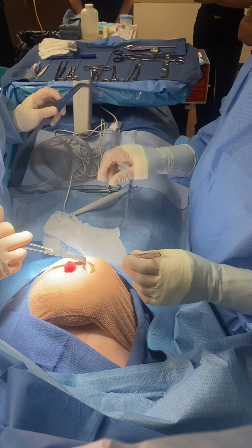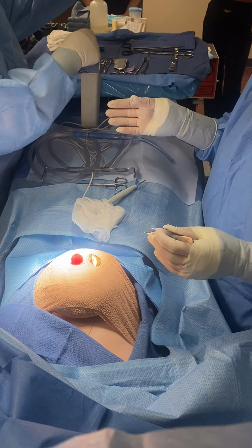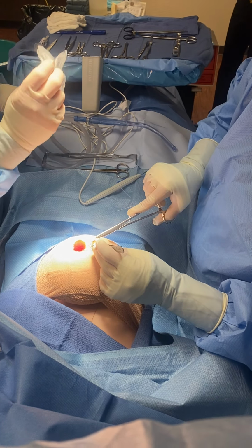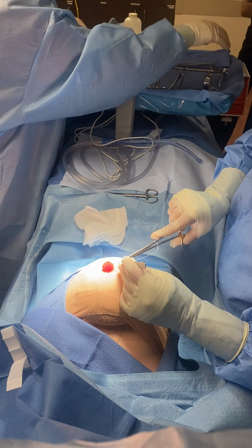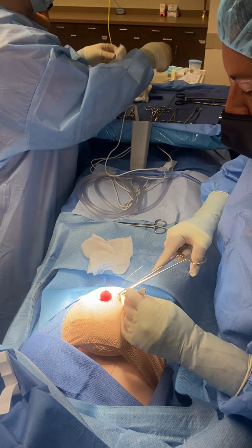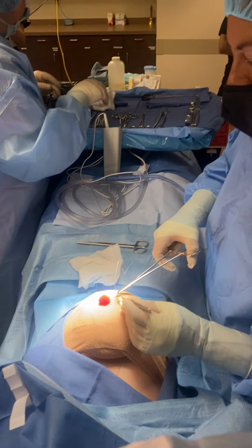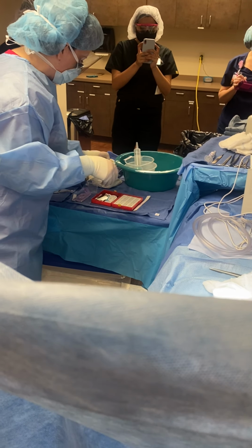All right, let's close her up. Send her home. Stitch. Thank you. Okay, could I start my count, please? Yes. All right, Raytex, I have one. I have more than that, hold on. 2, 3, 4, 5, 6, 7, 8, 9, 10. Thank you. Scissors are here, Doc, if you need them. Thanks. Laps, I have 1, 2, 3, 4, 5 soggy laps.